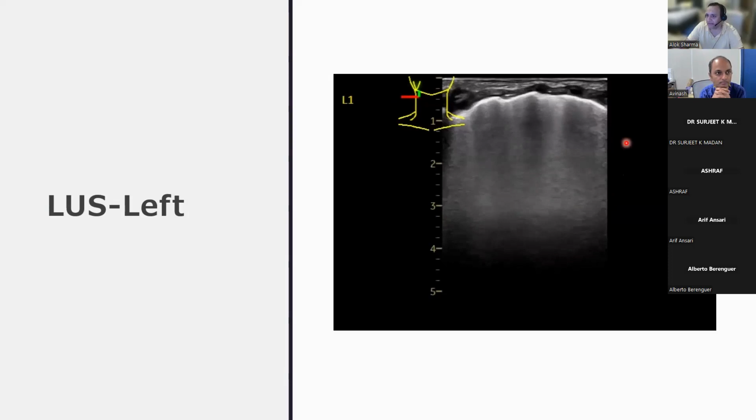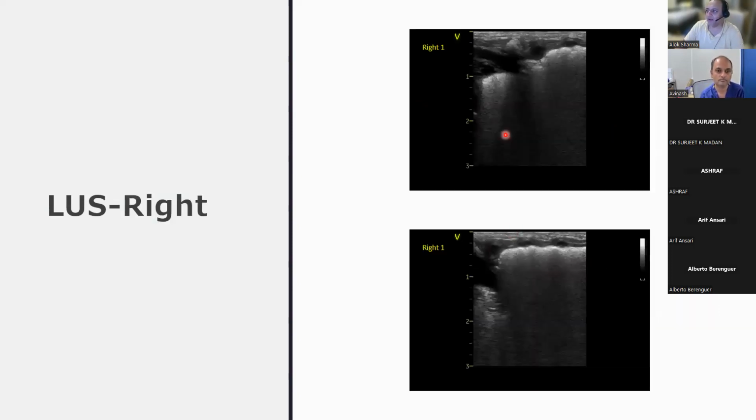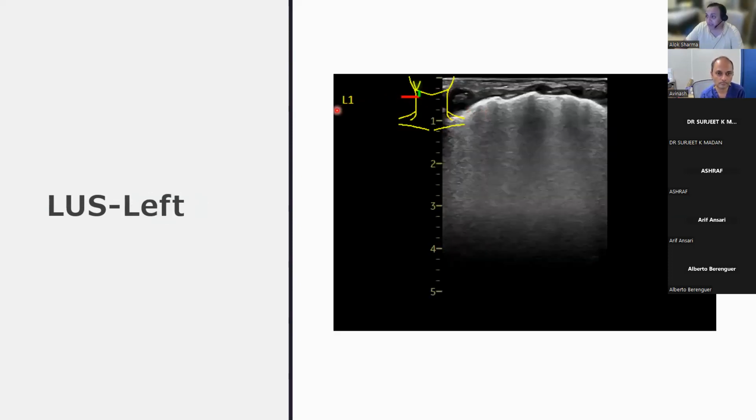Beautiful. So what I would say is, coming back from the last, we're going to look at all lung regions, then comment. Save it for all lung regions, because really what we should always do is we mental model, but we look at all lung regions. So let's just say that L1, L2, L3, L4 were all very similar, exactly like this, in the interest of time. If it is generalized, then RDS becomes more of a possibility rather than consolidation in one particular region.